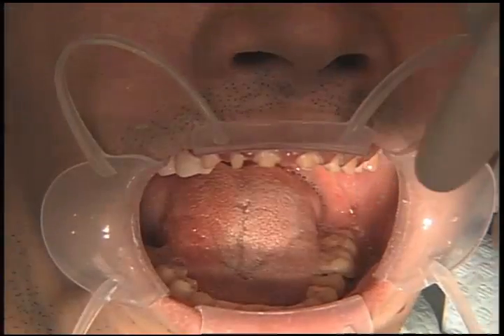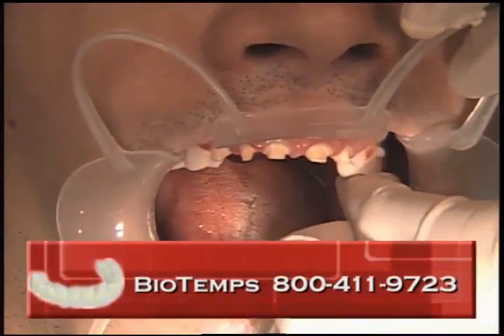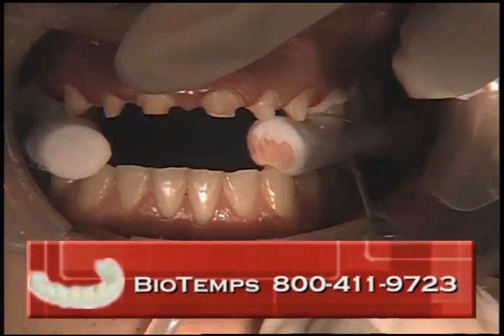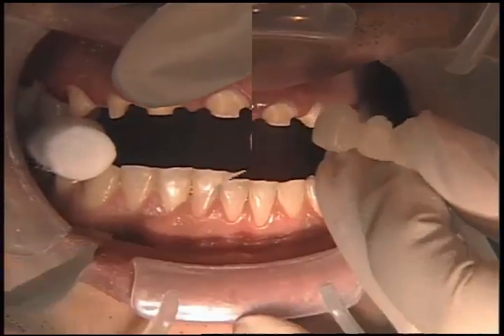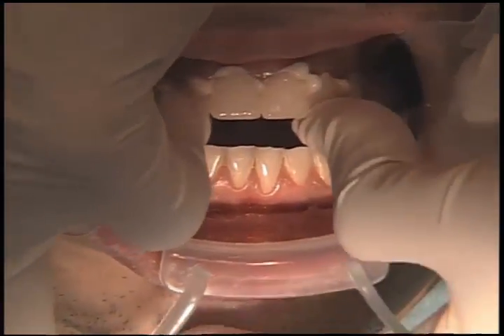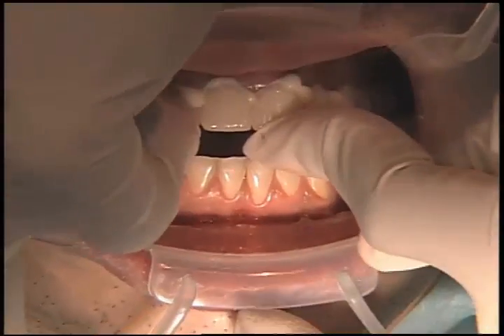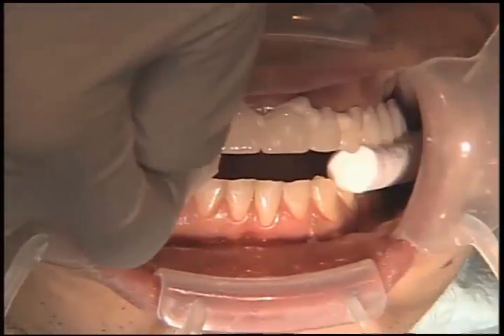We've now prepared all the teeth on the maxillary arch except for the second molars, and we're trying in the posterior segments of the biotemps. Since they fit, we're going to go ahead and reline those with the acrylic now, with the patient biting down on a couple of cotton rolls. While that is setting, we're going to go ahead and place the anterior units as well. I'm pushing these into place with my fingers, and as that material starts to thicken, we'll be able to remove some of the excess from around the margins and pump these units up and down on the teeth to avoid any undercuts.